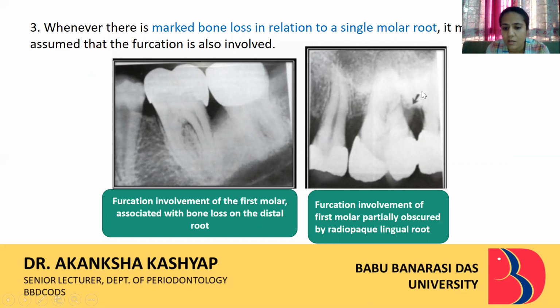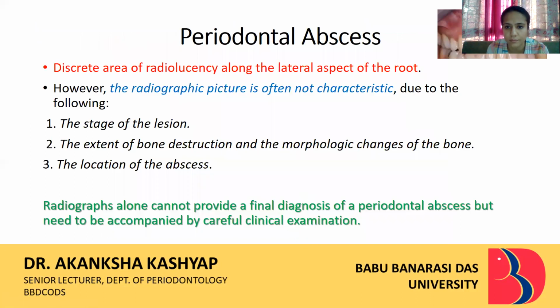Like here, this furcation involvement is there with respect to the first molar, but it is partially obscured because of the radiopaque lingual root. Because of this, the furcation involvement is masked. So clinically, we have to assess furcation involvement along with radiographic examination.